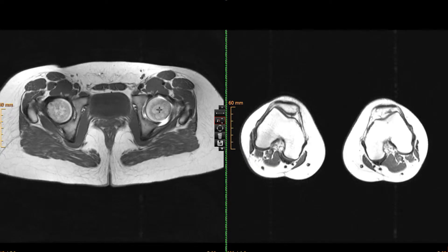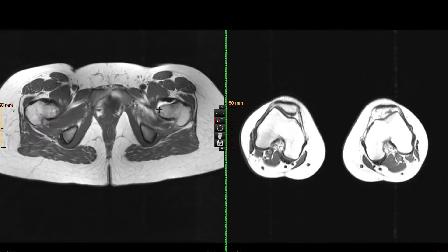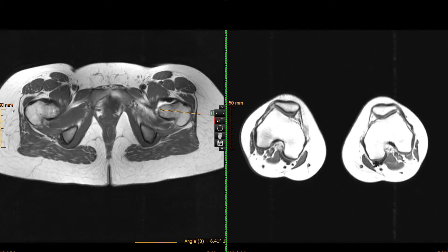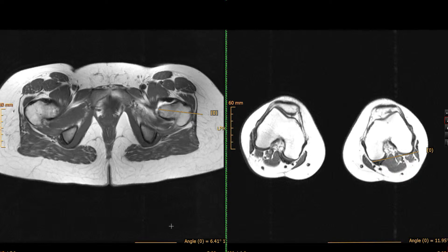You can measure the femoral torsion by measuring the angle of the femoral neck axis and then measuring the angle of the femoral condyles on the same side. You can use bone or cartilage — it doesn't matter. So we have 12 degrees here and 6 degrees here, giving a femoral torsion of around 18 degrees. You can do it on the other side for comparison to see whether there is a substantial side difference.